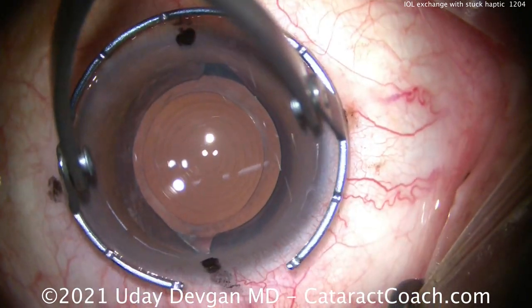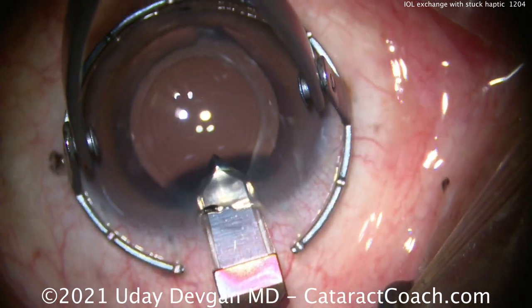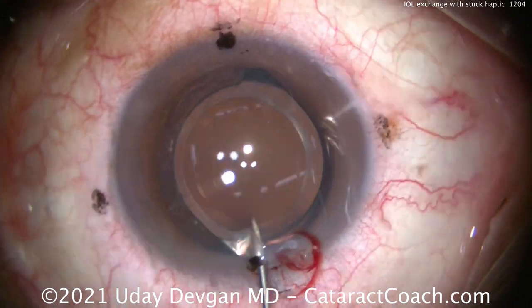Now for the main incision. I'm going to make my main incision 2.75 millimeters wide on the steep axis, which you can see is just about 95 degrees. There it is — nice tunnel construction. I nicked the limbal vessels. That's much better. It'll be much better for long-term healing.